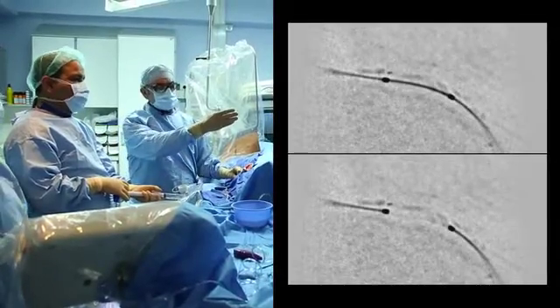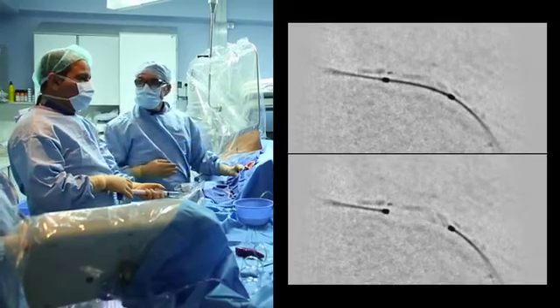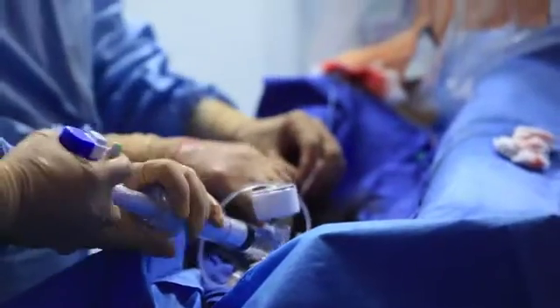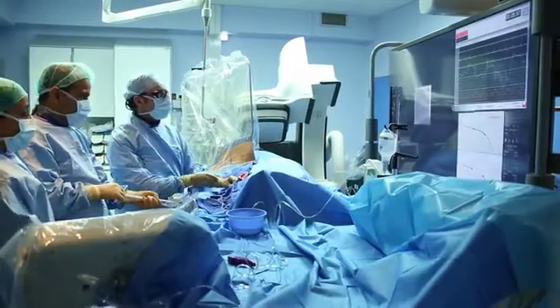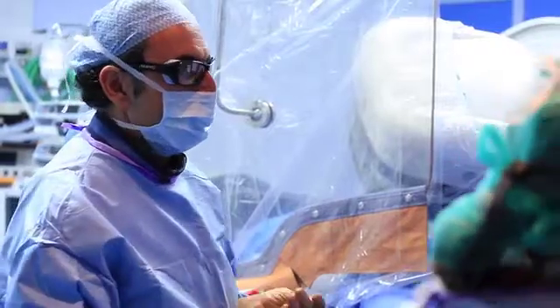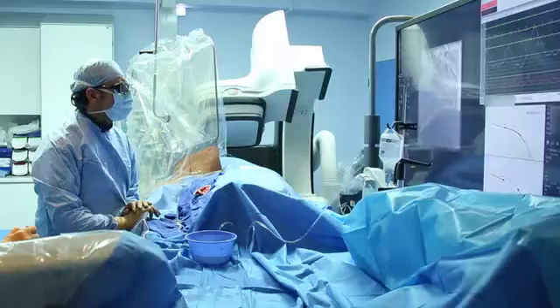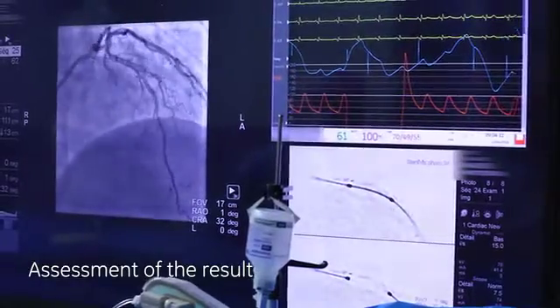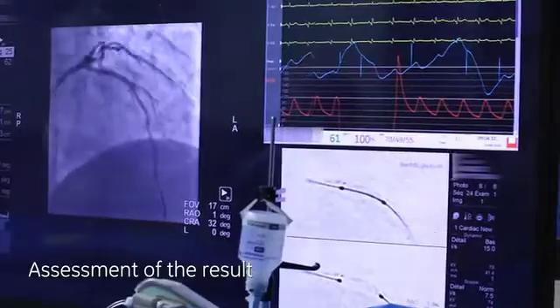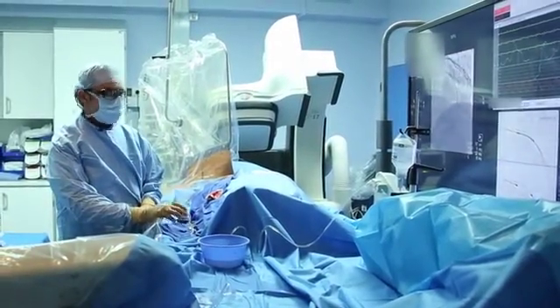As you can see now, the balloon is at the good position to do the optimization of the BVS implantation. Now we only have to check the result with an angio and the PCI will be finished. In my opinion, the result is perfect for the LAD and we haven't lost the small branch, the diagonal branch on this area.